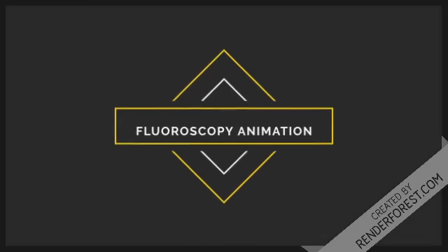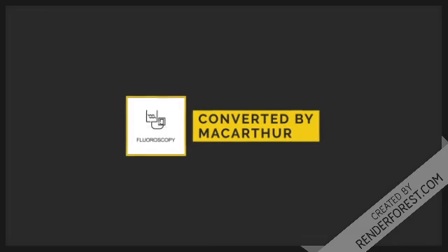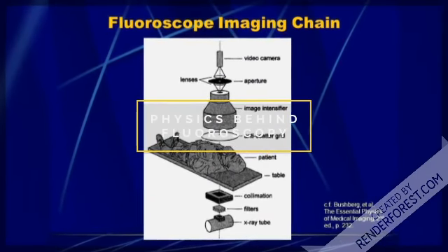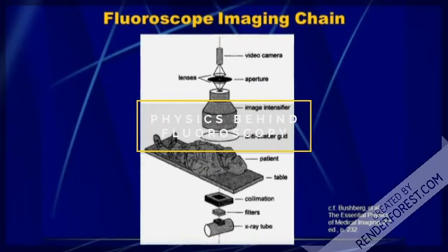During a fluoroscopic examination, the operator controls activation of the X-ray tube for real-time imaging of the patient. So, an X-ray beam is passed through the body. The image is transmitted to a monitor so the movement of a body part or of an instrument or contrast agent through the body can be seen in detail.